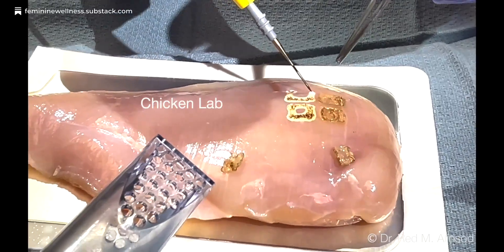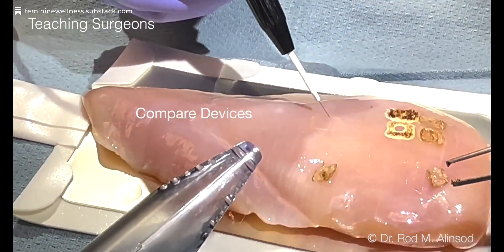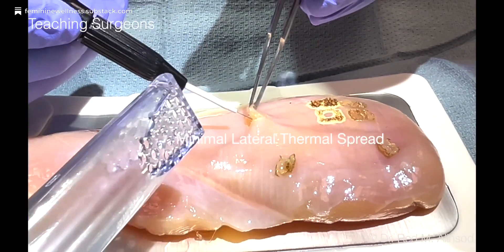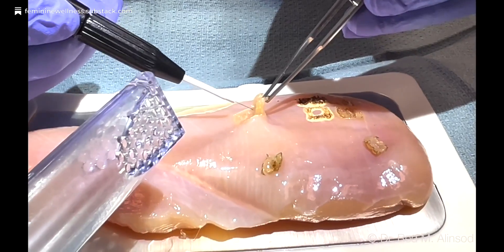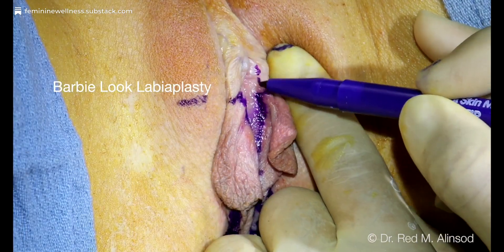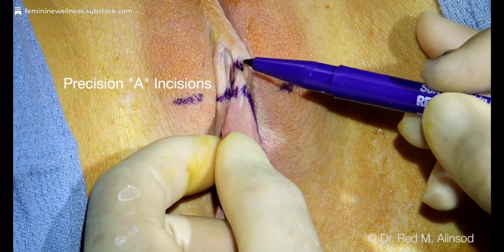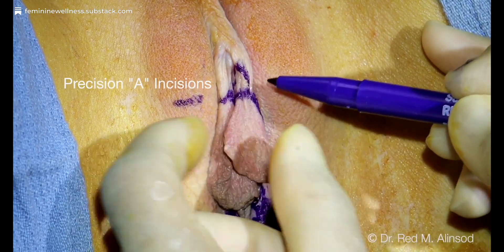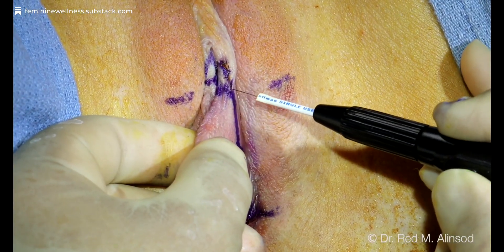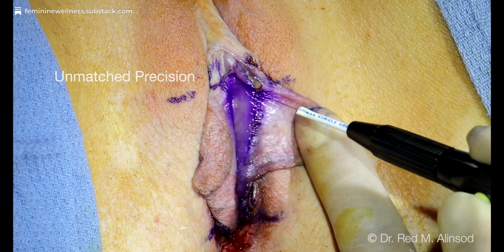I do a chicken lab — it's a world-famous chicken lab — and we compare devices: both standard cautery, 980 diode, and this very precise radiosurgical device with a fine hair tip. It's able to cut tissue with minimal lateral spread. It uses radio waves right in front of it, dissipates water, the water explodes, and it cuts very precisely. I use it for precision incisions on labia minora, doing my A incisions using the radiofrequency device to prevent dog ear formation. It is unmatched in its precision with a lateral thermal spread of about 10 to 20 microns.